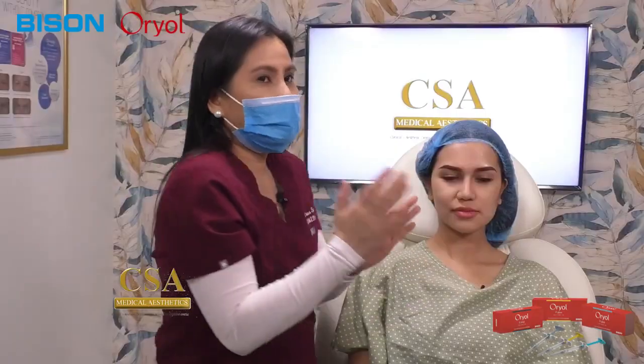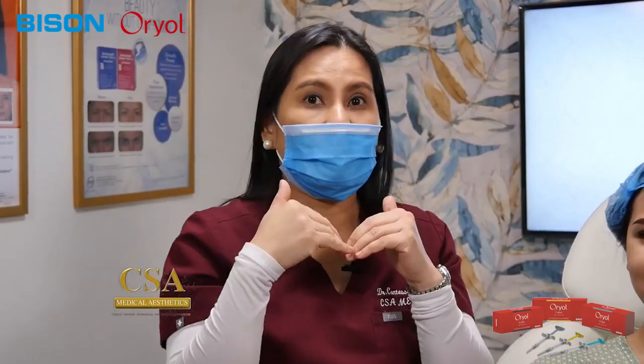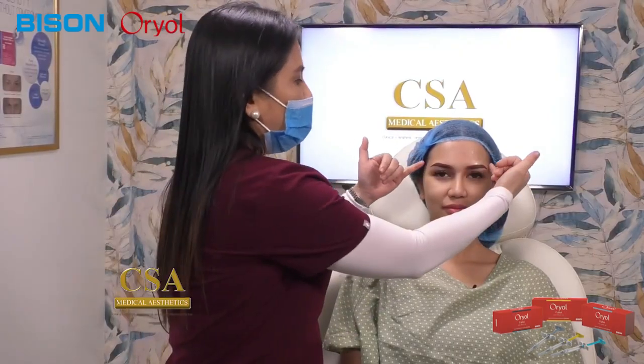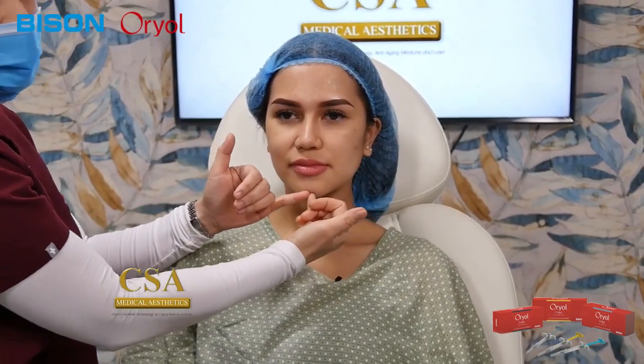Okay? I'll also be doing a so-called inverted triangle treatment or the triangle of youth treatment for Miss Kim. Okay? So working on the temple, working on the zygoma here, and the center, the chin. We'll be doing an assessment of that. We'll show you when CSA Medical Aesthetics return.